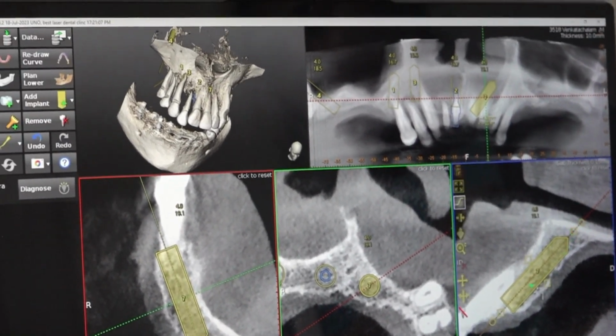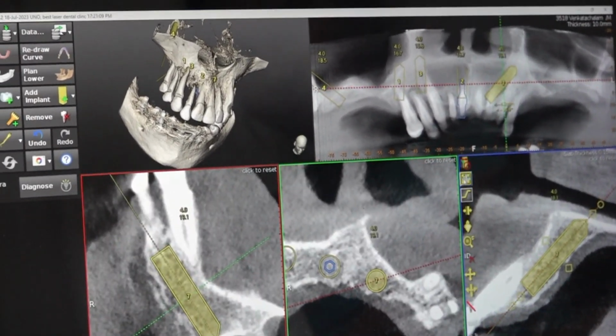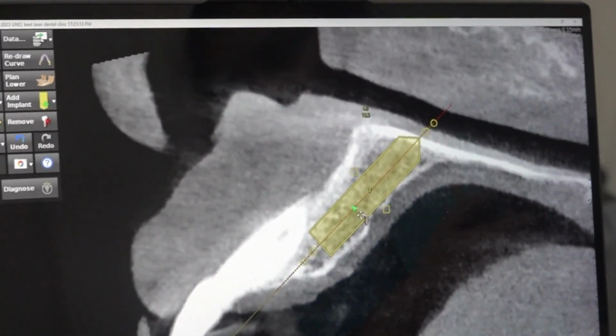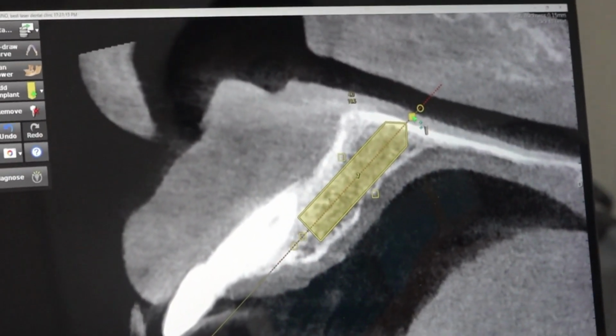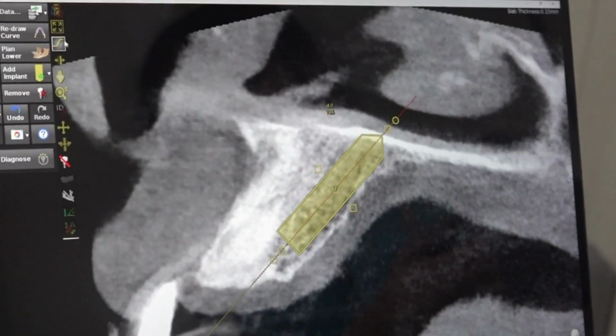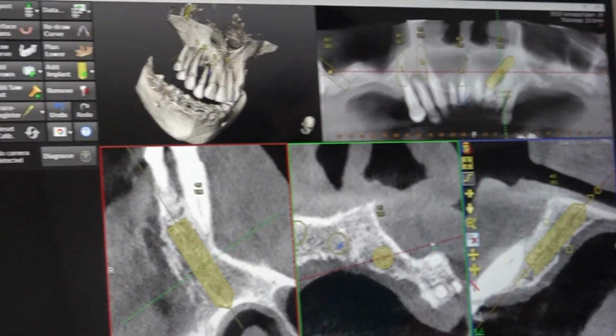Here also the bone is good. Anyhow, we are going to use a compressive implant of 15 mm. That is the maximum length available here. If you want to engage the cortical bone, then you have to use a 20 mm or 23 mm BCS.